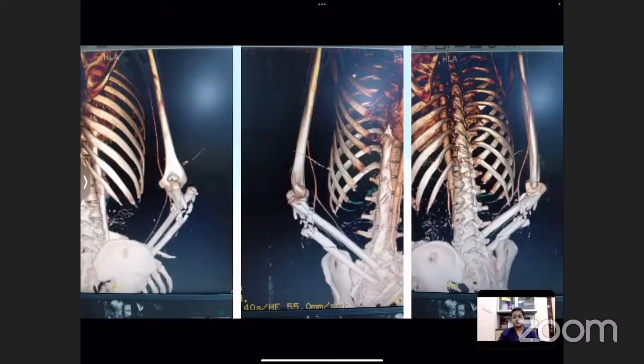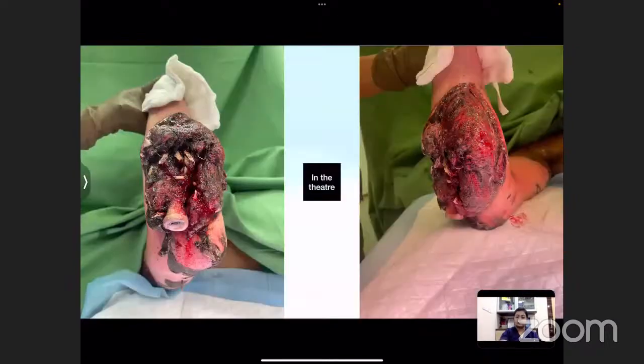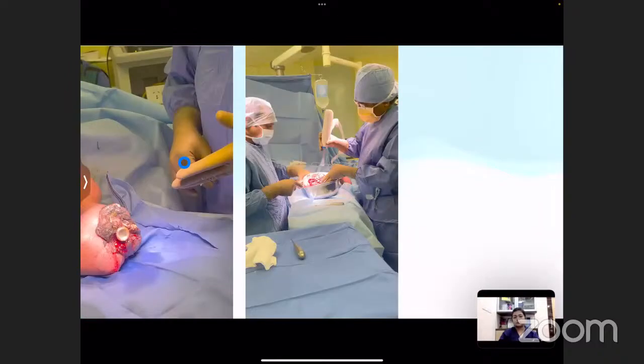Before doing that, you can see the 3D CT scan with the angiogram. Brachial and radial are intact, so there is no threat to the vascularity. But we can see clearly the ulnar comminuted fracture and ulnar shaft fracture with radial head dislocation. These are the pictures of the angiogram, and I'll show you each and everything. I've taken some videos. Sorry, I'll go back.